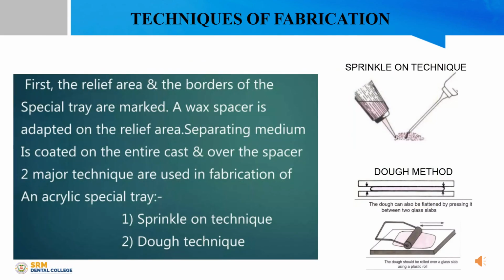Moving on to the techniques of fabrication. When a resin-based material is used, there are two methods that can be used for fabricating the special tray. One is the sprinkle-on technique and another is the dough technique.